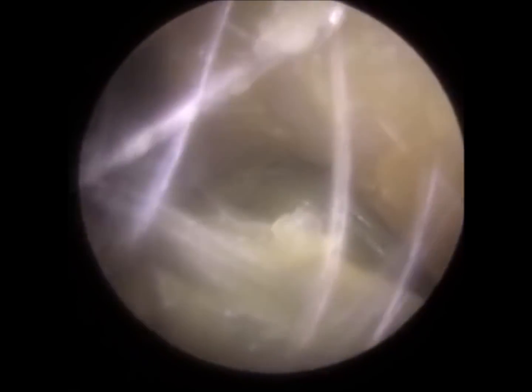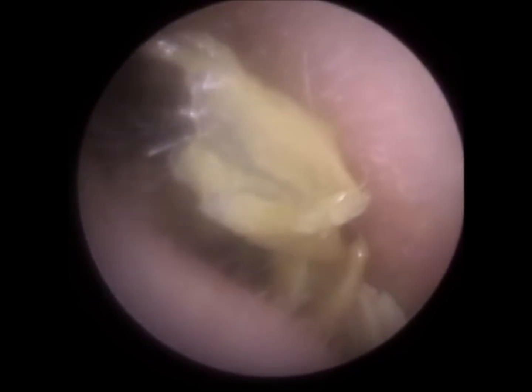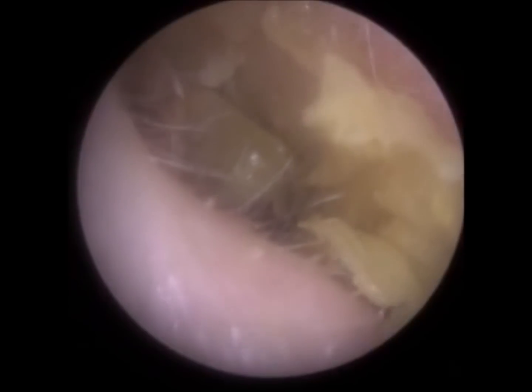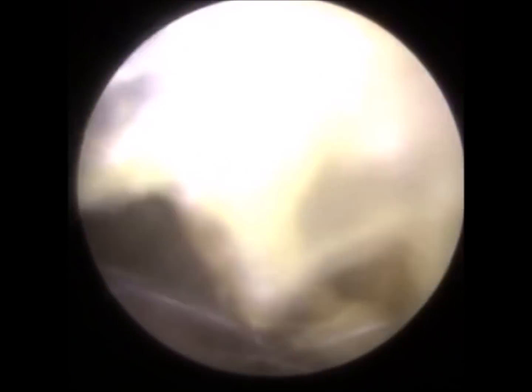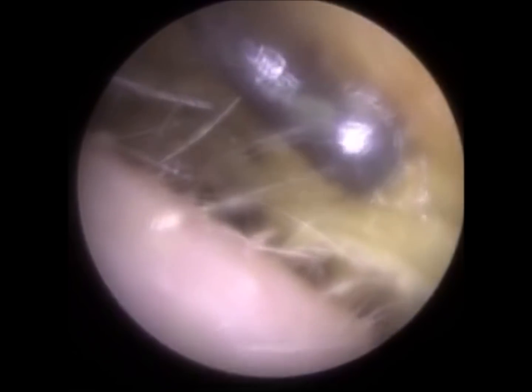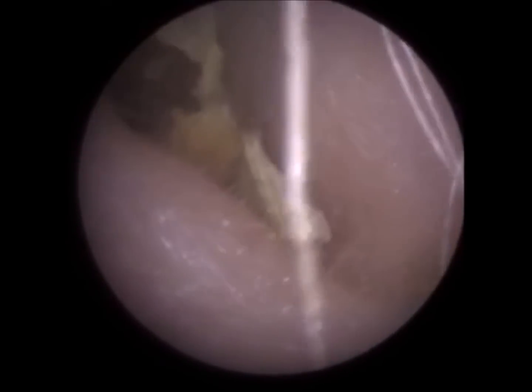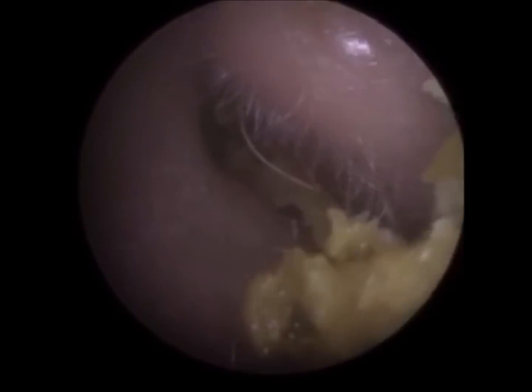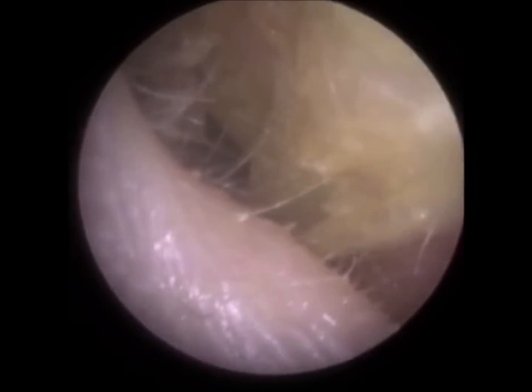So I've just gone in with the ear hook, and the idea is to get as deep as possible, trying to get in behind this plug of dead skin, but we could only get in almost halfway down the ear canal, because this was impacted against his eardrum, so you can't really insert that instrument too far without safely seeing what's going on there. You can see I'm just dissecting some layers of skin, some dead skin ribbons, and I'm just using some forceps now. At some points during the procedure, the forceps were very good, very beneficial. Just like here, it took a few layers of dead keratin out in one go. But at other stages, it was just simply removing single ribbons.